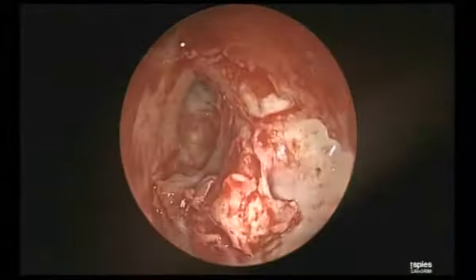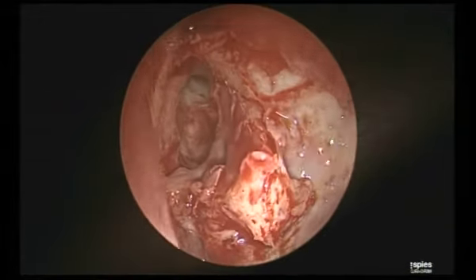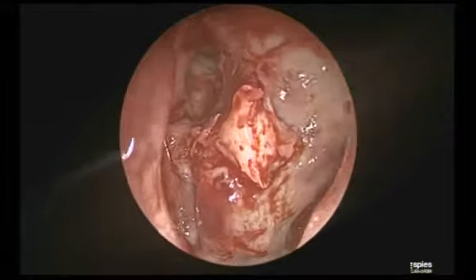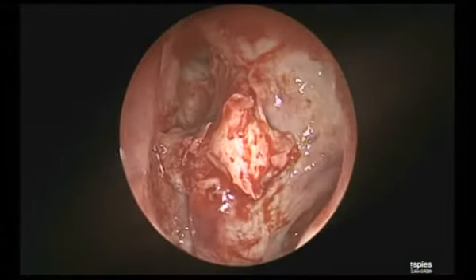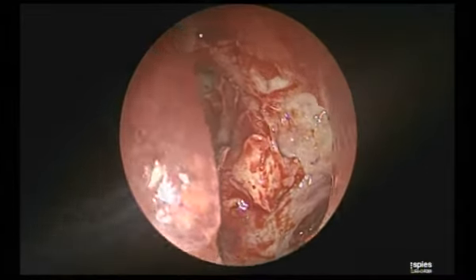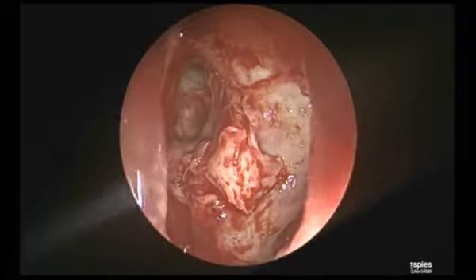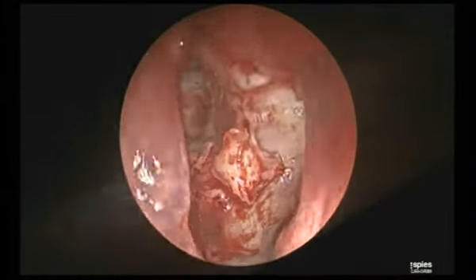Now, the third thing which we discussed about, anterior ethmoidal artery preservation, or this intact bulla technique, I said, as long as the bulla is intact, the anterior ethmoidal artery remains behind it. Now see how it protects the bulla. See what I am doing now. This is the bulla now with the 70 degree.